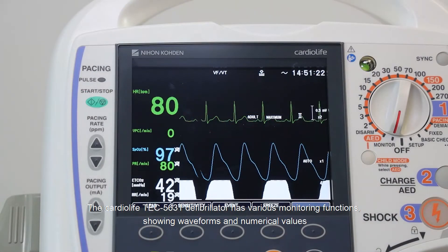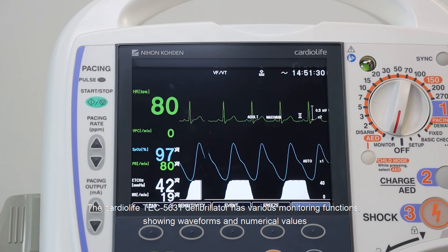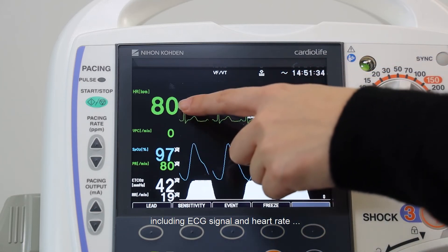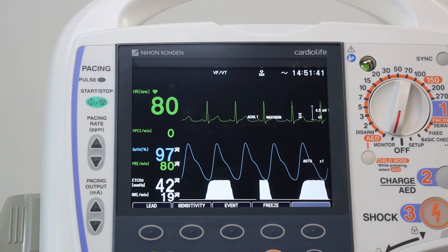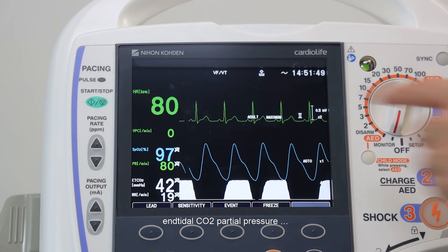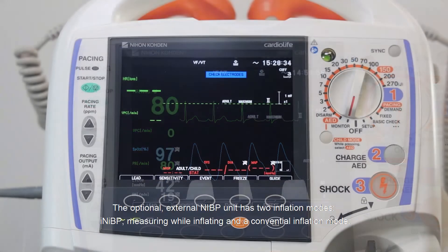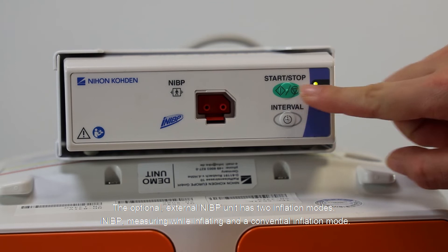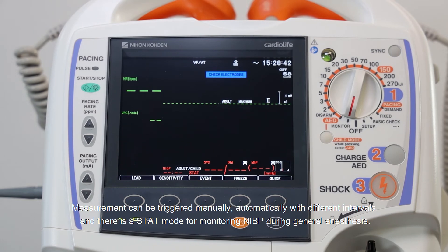The Cardiolife TEC5631 defibrillator has various monitoring functions showing waveforms and numerical values, including ECG signal and heart rate, SpO2 value, pulse rate and SpO2 curve, as well as CO2 waveform, tidal CO2 partial pressure and respiration rate. The optional external NIBP unit has two inflation modes: i-NIBP, measuring while inflating, and a conventional inflation mode. Measurement can be triggered manually, automatically with different intervals, and there is a STAT mode for monitoring NIBP during general anesthesia.